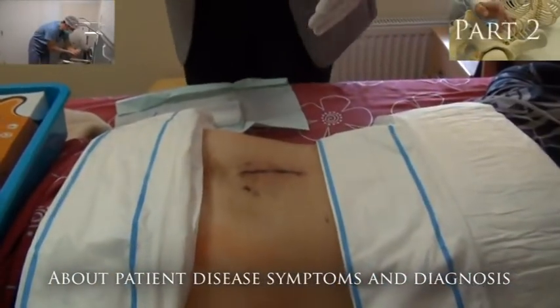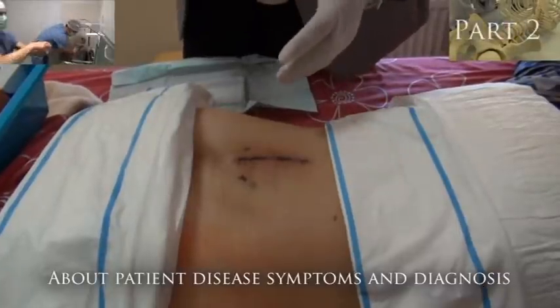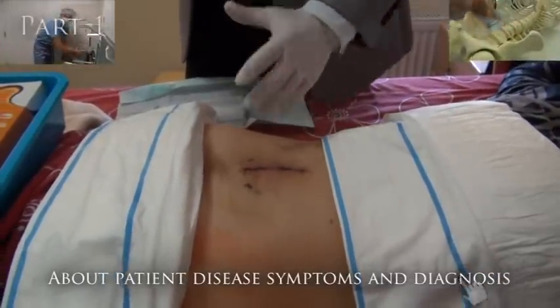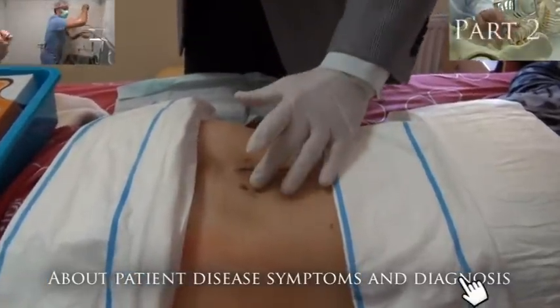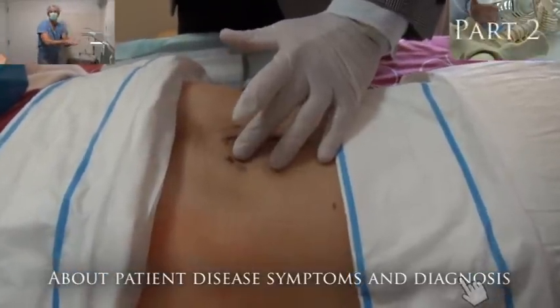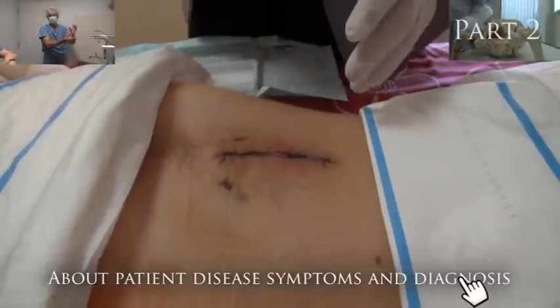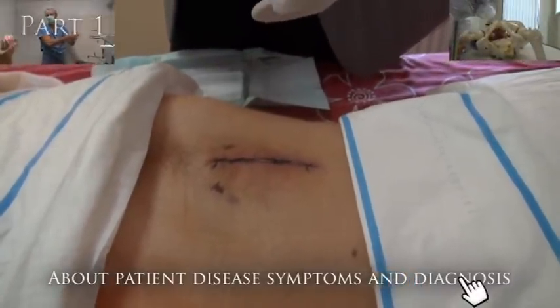This incision is approximately six to seven centimeters long — pretty similar to the front. There is a little difference: from the front I am not using drainage, but from the back we are using drainage. Here you can see the holes on the right side and left side where the drains were removed.